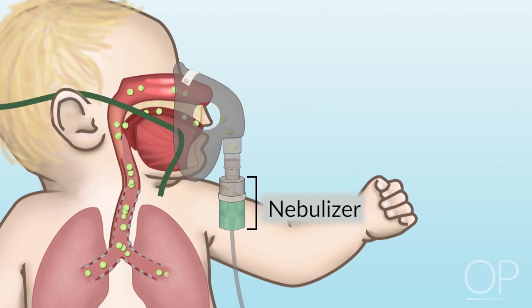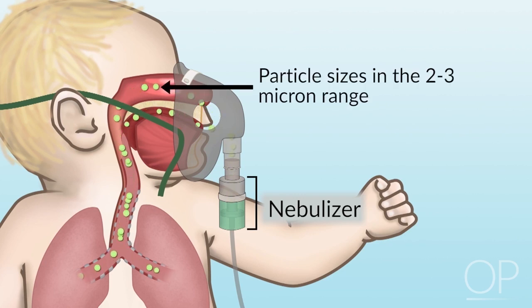Appropriately performing nebulizers will produce particle sizes in the 2 to 3 micron range, which will ensure adequate delivery to an appropriate portion of the respiratory tract.